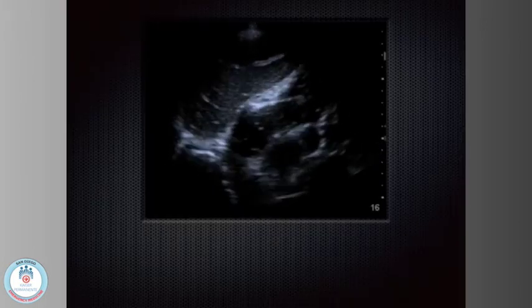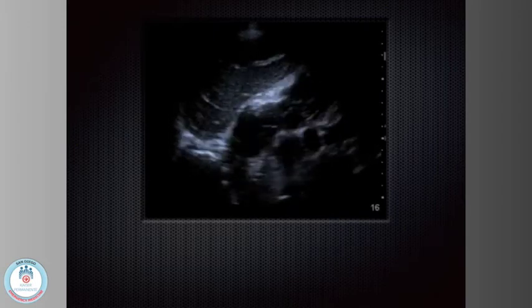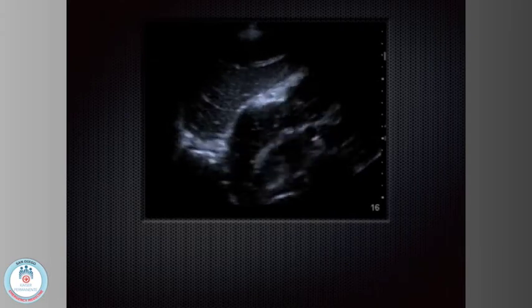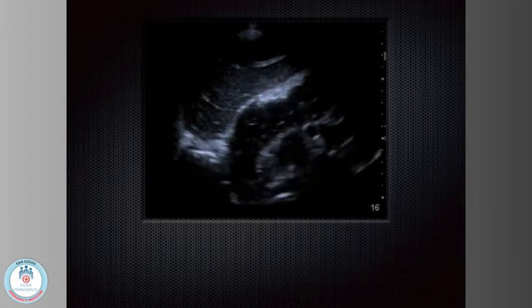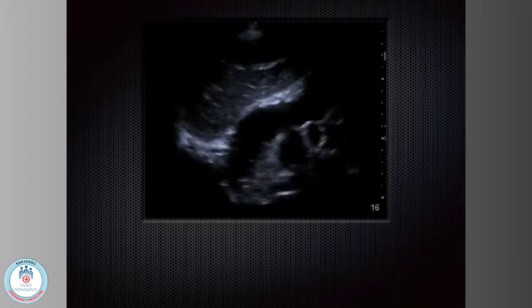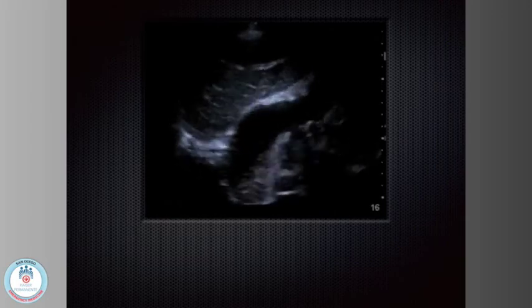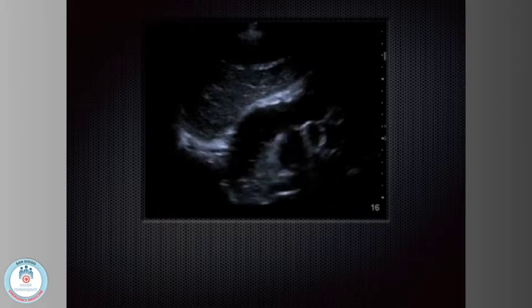Well, the other thing is placement of how deep the line is. As all the residents here should be doing with every single line that we place, at least with me, and I'm sure with several of the ultrasound faculty, start using ultrasound now, and order the chest x-ray for the hospitalist, right? That's their Christmas gift. This is our Christmas gift. But as far as how deep it is, that's somewhat helpful.